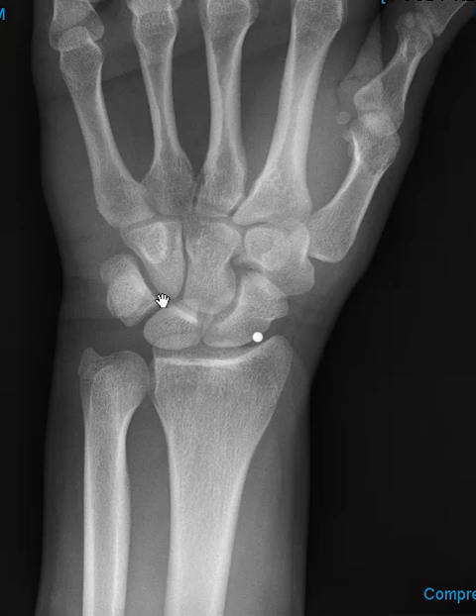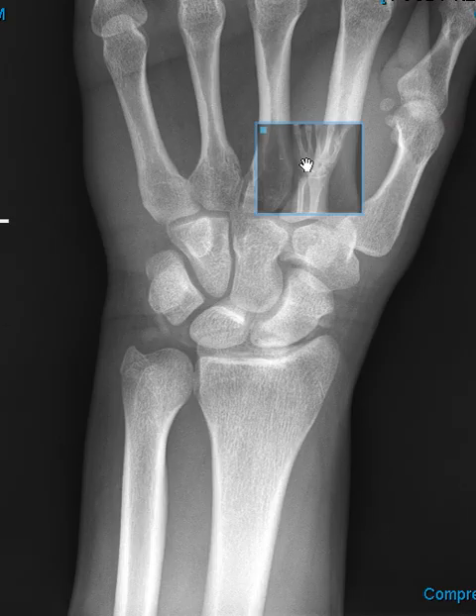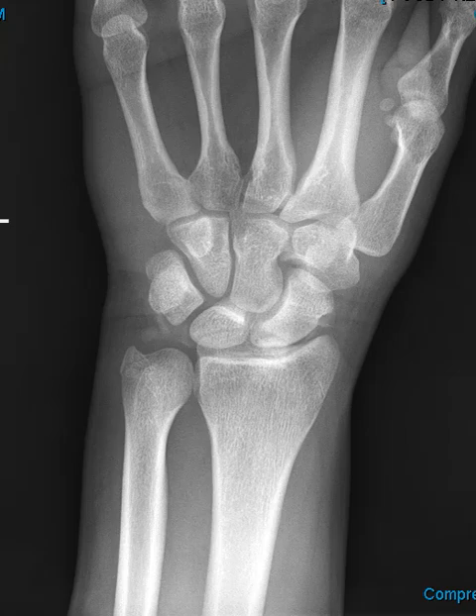So lately I've been doing it over here. I'll go around the mid-body of the scaphoid on the proximal end and put a needle in — a 25-gauge needle, a short needle — and aim for the back edge of the scaphoid bone. There's the needle looking right down the barrel. I'll go down and inject contrast.